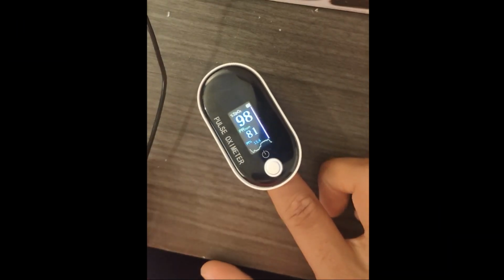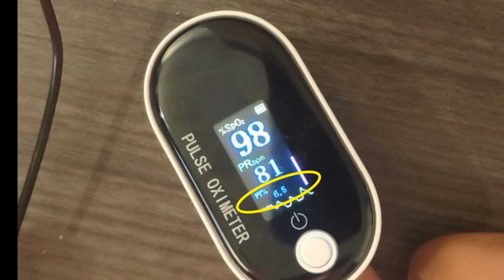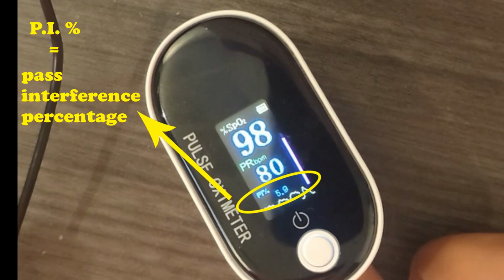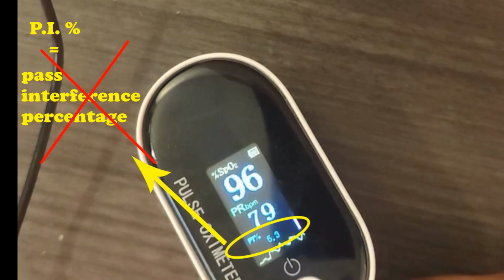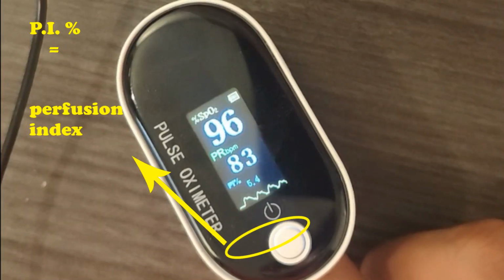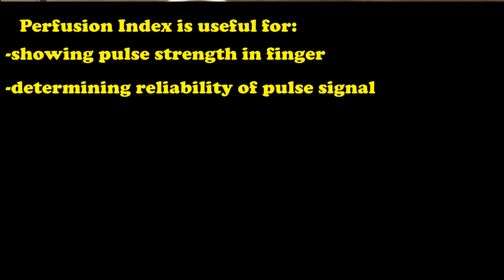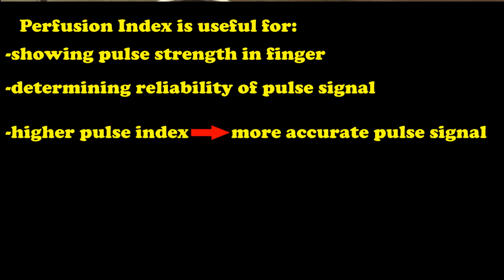And that third little measurement at the very bottom that says PI% does not stand for pass interference percentage. Instead, it's talking about your perfusion index, which is used to show the strength of the signal you're receiving from the pulse in your finger. It's really good for gauging whether the signal you're currently getting is a reliable, strong signal, or if you need to fix things up to get a bit more high percentage.